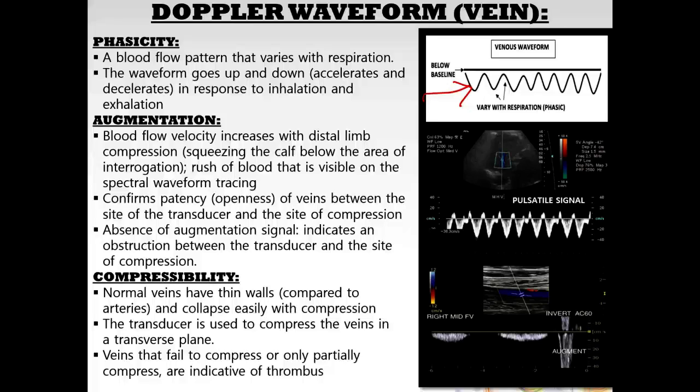Augmentation. So this is where when you squeeze a limb or a part of the body below the area that you're looking at, you should get this rush of blood flow that's visible on the spectral waveform tracing. This is what it looks like. So here's your normal pattern, and then you squeeze and get this rush of blood flow. If you squeeze and get a rush of blood flow, you know that vessel is open or patent. If you don't get this rush of blood flow, which we call augmentation, that vessel is not open.